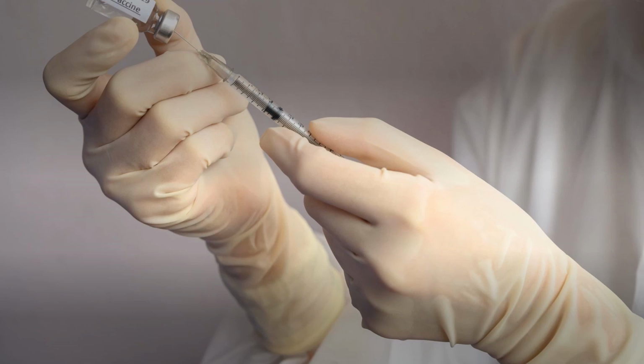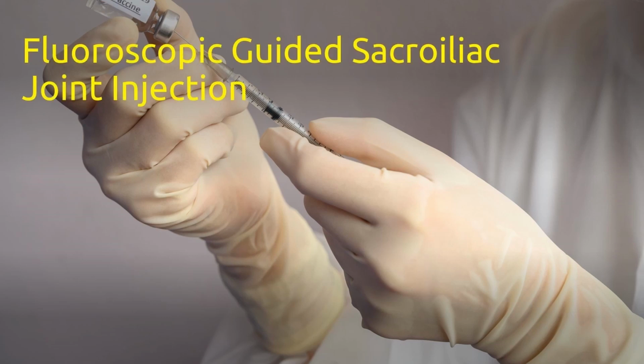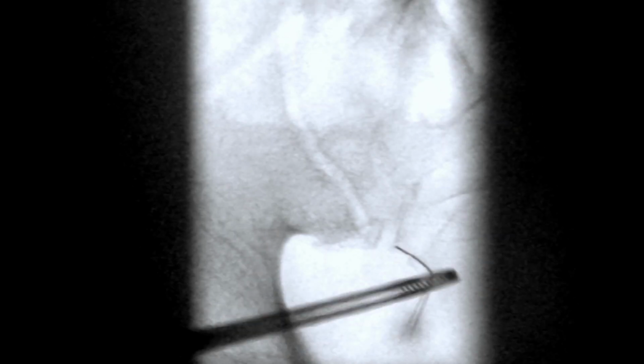The sacroiliac joint injection. Sacroiliac joint injections are used as a treatment for pain originating from the SI joints. These injections usually contain a corticosteroid to relieve inflammation and pain. The procedure is typically performed under fluoroscopic guidance to ensure precise placement of the medication, but it can be replaced by the ultrasound-guided procedure. The next demonstration will present the inferior recess approach to sacroiliac joint injection.